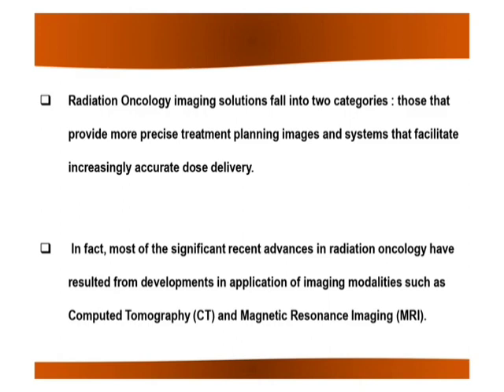You see, there are multiple CT scan images in which the tumor is there. We draw the contouring after the CT simulation, and then a volume of data is collected, and now on a computer we create a digitally reconstructed image, that is a projectional image. Now we know the area to be irradiated.